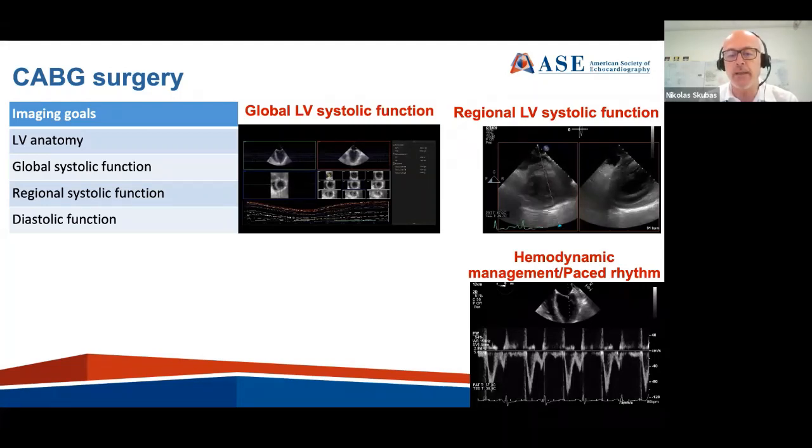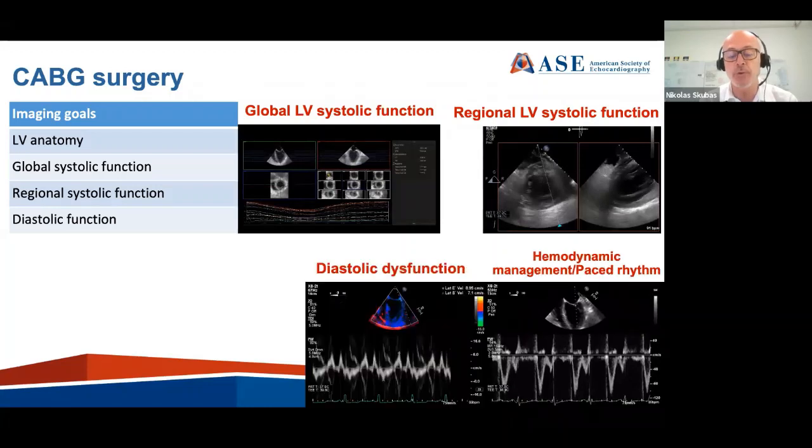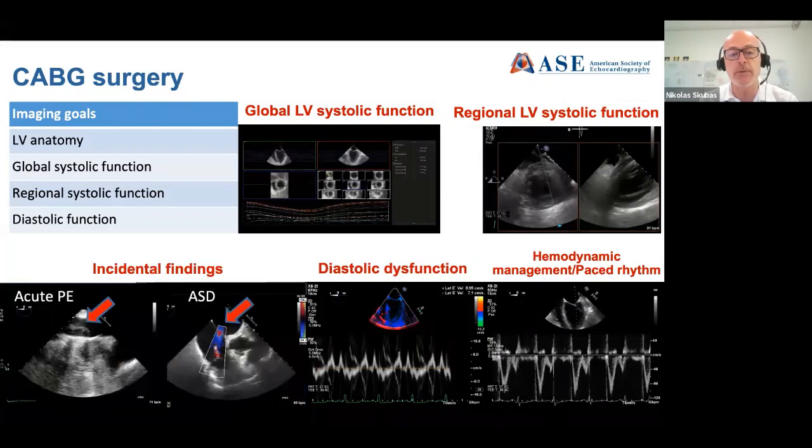So it's not only to detect the diastolic grade that can change because of fluid, but here in this case, you can tell that the atrium is contracting. So in case of AV pacing, you do know that you effectively have captured the atrial activity. You can match it with a Doppler tissue imaging of the lateral segment. So we can quickly do an E over E prime and get an estimation of the mean LV filling pressures, as well as the E prime A prime ratio, thinking along the diastolic function, as well as keep looking because sometimes incidental findings may explain, say, an increased CVP or signs of RV failure.